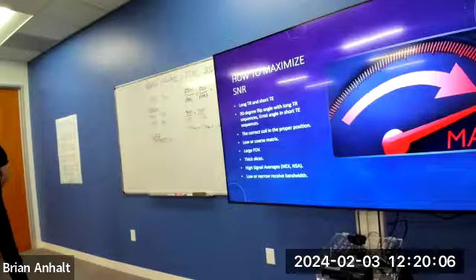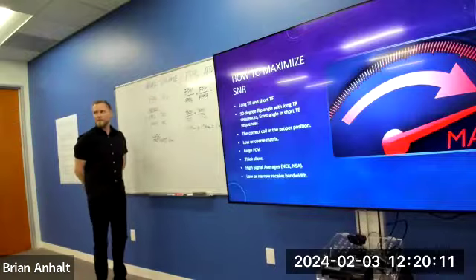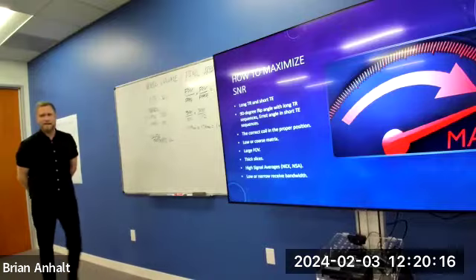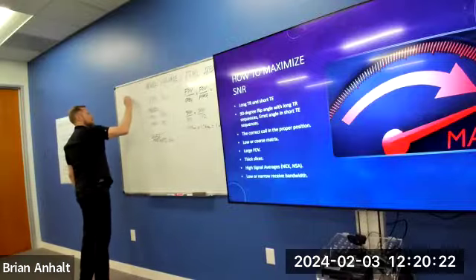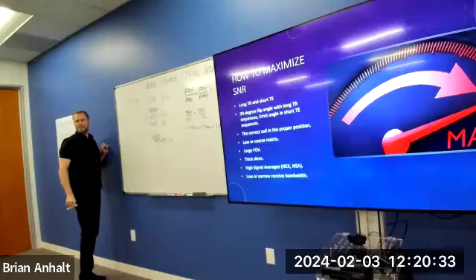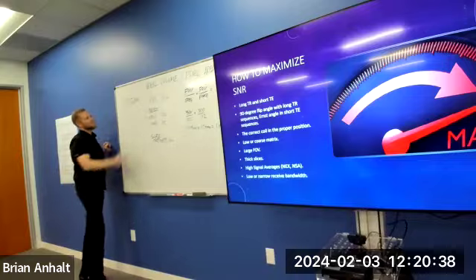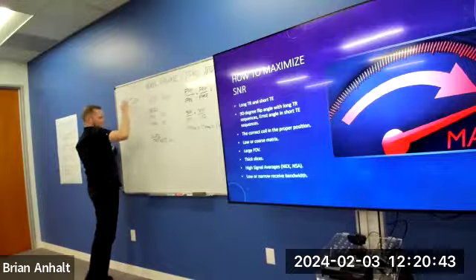And you can use a calculator to do this. You just have to remember, get your field of view in millimeters. It might be given to you in millimeters, but if it's not, make sure you get it in millimeters. So just add a 0 to the end. Right? And if it's like this, say this is your field of view, how do I get that in millimeters? Just move the decimal place over. You're just multiplying by 10. I've had people before just add a 0 to that, and that doesn't work. So just multiply by 10, move your decimal place over.